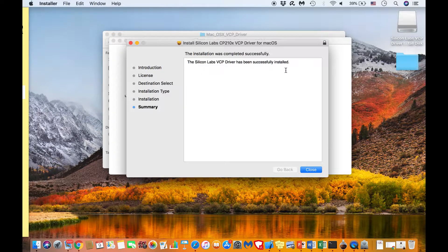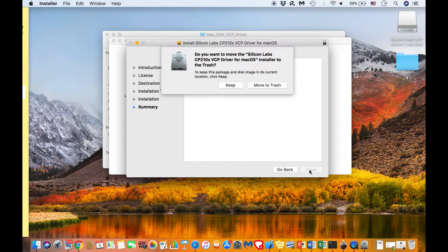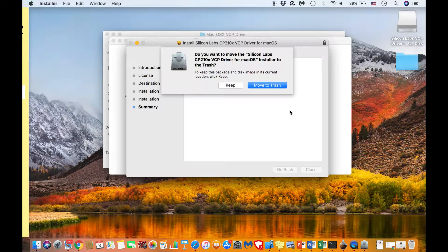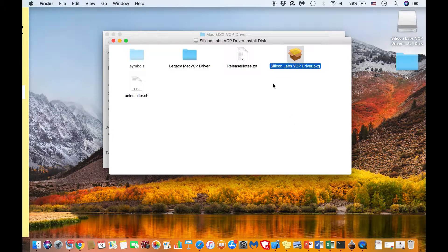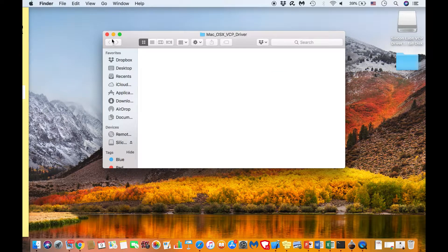When it is successfully done, you will see a prompt indicating the same thing. Hit close. You might be prompted to delete the installer file. At this stage, you do not need the installer file anymore and you can delete it.